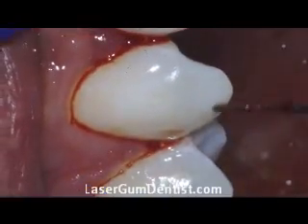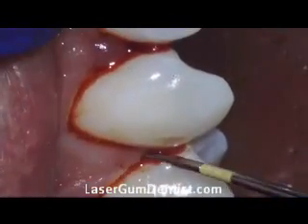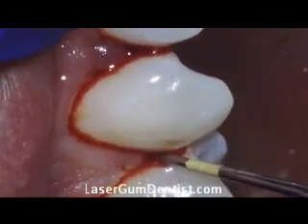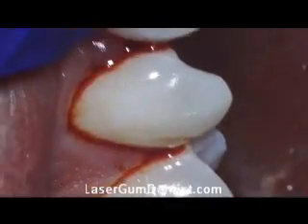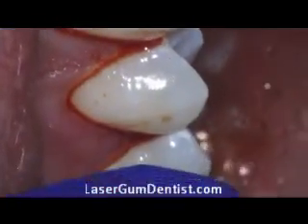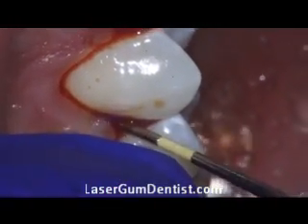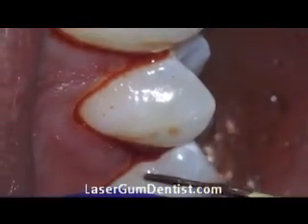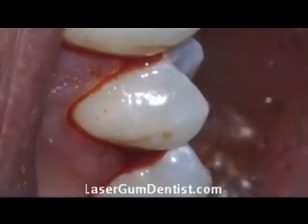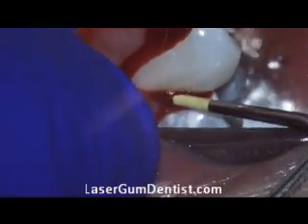The true advantage is the regenerative properties of utilizing a laser — not just the antibacterial effects, but actually at a histological level. There have been two papers published that show at a cellular level that we're getting regeneration, and the advantage to the patient is that it's minimally invasive with minimal discomfort.